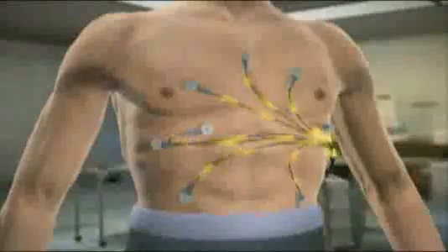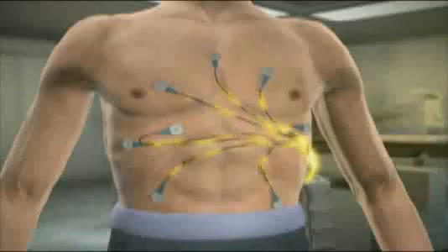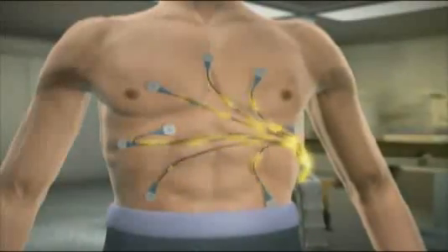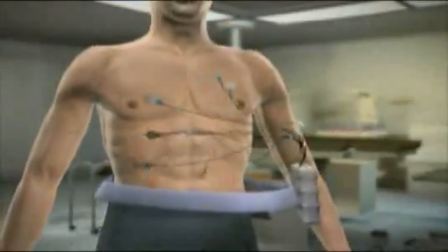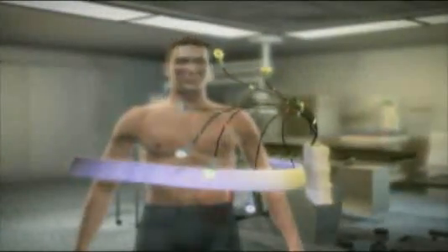Sensors on the patient's abdomen send these images to a receiver worn on the waist. After 8 hours and over 50,000 images, the sensors and receiver are removed. The images can then be downloaded to a computer where they are viewed as a video and examined by a doctor.